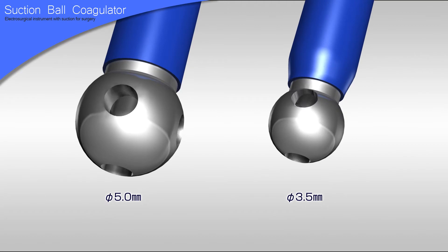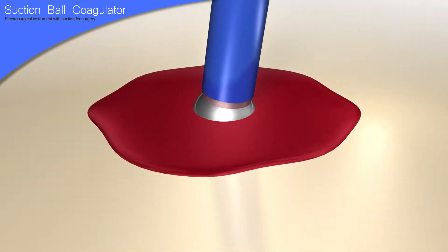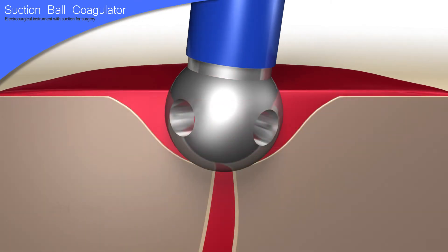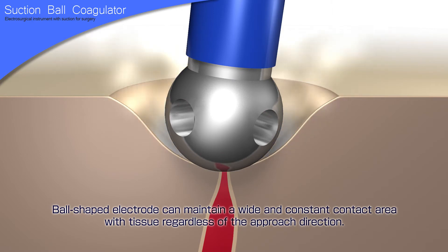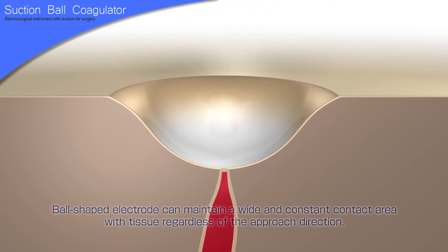Electrodes are available in two sizes: 3.5 mm and 5.0 mm. The most significant feature is that the ball-shaped electrode can maintain a wide and constant contact area with tissue regardless of the approach direction, which allows for effective bleeding control.